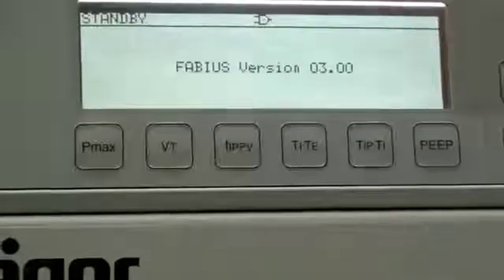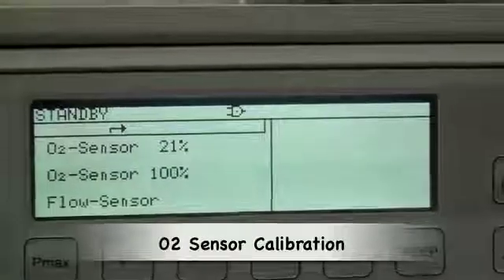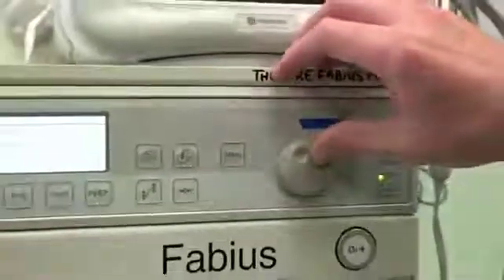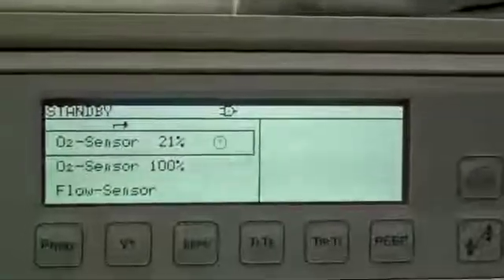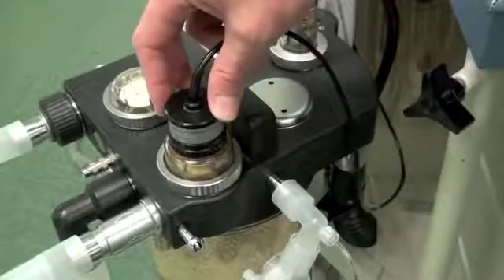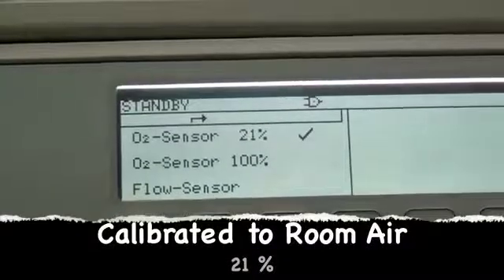Part of the gas check is to calibrate your oxygen sensor. The oxygen sensor can be calibrated to room air, which is 21%, or to 100% oxygen. To calibrate to room air, one selects the O2 sensor at 21% and turns on the medical air. The oxygen sensor is located at the inspiratory portion of the breathing circuit. A tick now indicates that the oxygen sensor is calibrated to 21%.